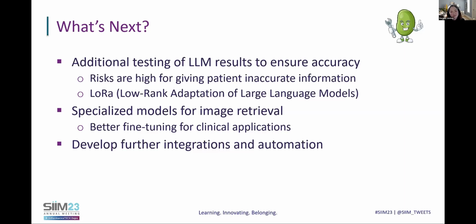Next slide, Adam. Okay, what's next? Obviously this is just a prototype. We would need to do some additional testing of the LLM results to ensure accuracy. We don't want to give patients any bad information that could be detrimental to their care. We'd also want to do some specialized models for image retrieval, and better fine tuning for clinical applications.